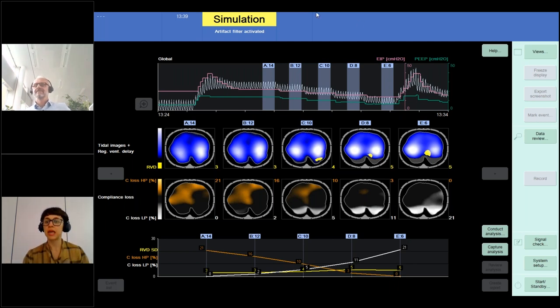Thank you so much, Eckhard, for this excellent demonstration. I think you had really a great number of examples of different types of patients, because in a lot of cases, our customers have asked, even in the first webinar, what kind of patients would benefit, what kind of therapy interventions we can apply PulmoVista to. And I usually respond to them, well, basically in any kind of patient that doesn't have open wounds around the chest area, so basically for the belt positioning. But there's really a diverse set of patients that we can connect and we can get the clinical data from. So thank you for this. I think it was quite extensive and quite detailed.